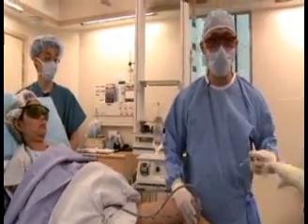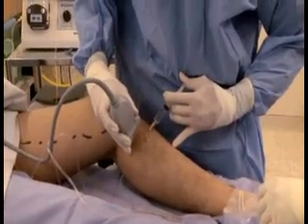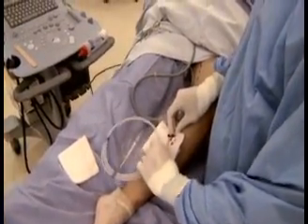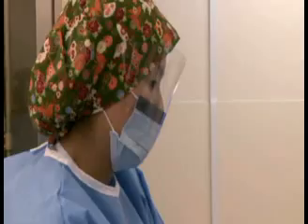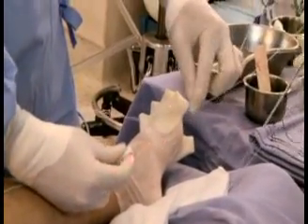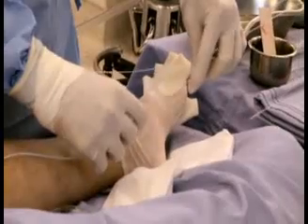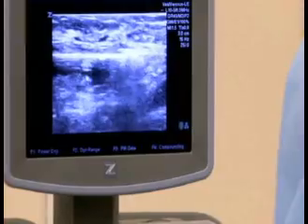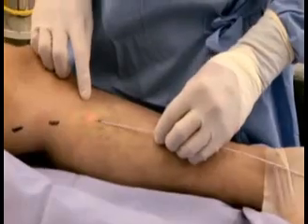Usually we give the patient some local anesthesia in order to numb the skin around the region. A needle is then placed into the lower end of the vein, through which a small sheath is inserted. And this is when the magic starts. This is a laser fiber. You can see the light shining on the laser. And the laser fiber will go inside the catheter. Laser energy is then delivered to the fiber, which causes the vein to close as the fiber is gradually removed.